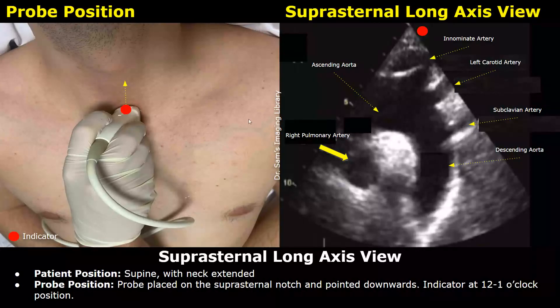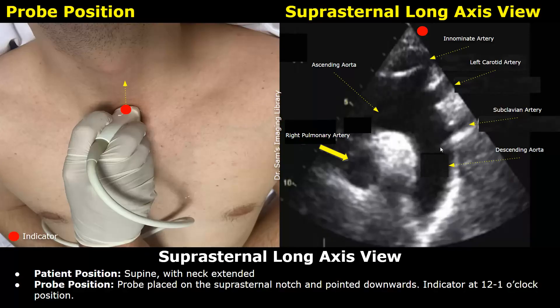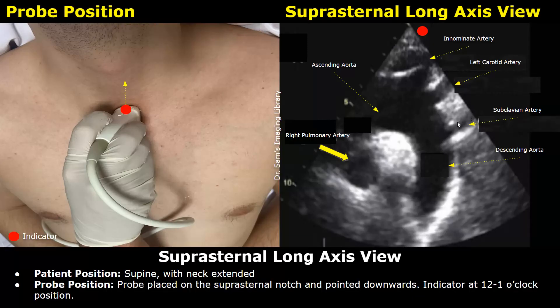The suprasternal long axis view is helpful in examining the aortic arch. The patient lies in the supine position with the neck extended. Place the probe in the suprasternal notch with the indicator towards the patient's head, pointed downwards. You will see the aortic arch with the ascending aorta, descending aorta, and three branches: the innominate artery (brachiocephalic trunk), the left carotid artery, and the subclavian artery. The right pulmonary artery is also seen in cross-section.